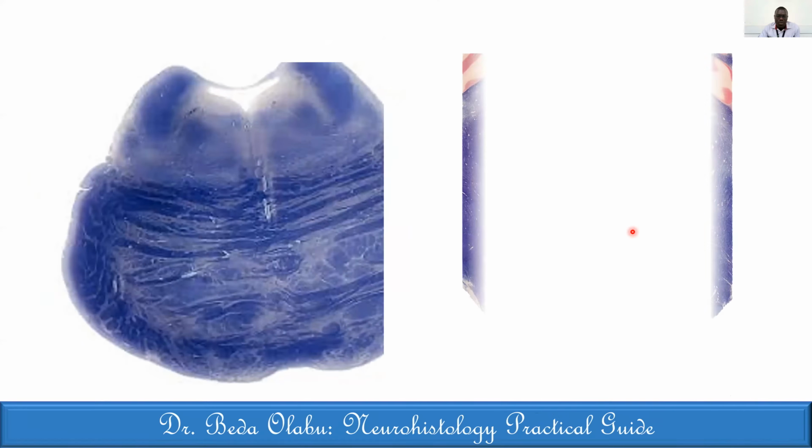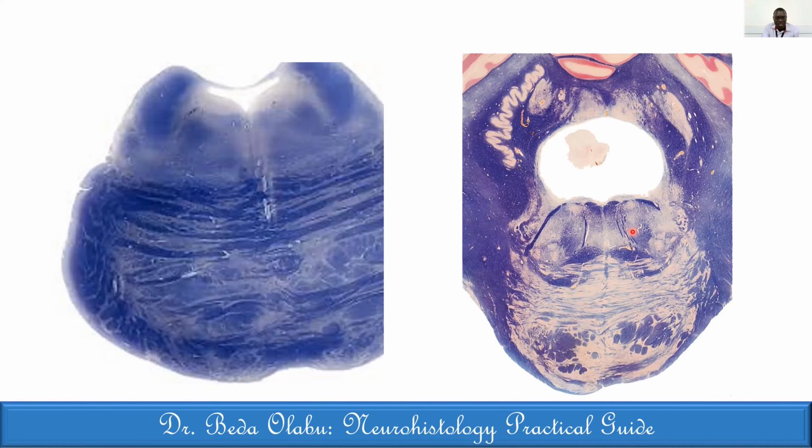This is showing you the slide of pons. Now that's the only brainstem part that we have not talked about. So how do we know this is pons? It's quite characteristic about the zonations. Let's start with the first slide there. The ventral side and the dorsal side are slightly different. The dorsal side is relatively compact, and the ventral side is not as compact.